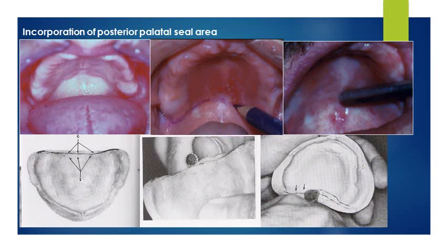About the posterior palatal seal, it occurs, as we know, in the upper arch from the hamular notch here to the other hamular notch here. We should draw a line with an indelible pencil between the hard palate and the soft palate, at the beginning of the soft palate, but it should go no more posteriorly because that will be a movable part. We should place it in the immovable part at the beginning of the soft palate.